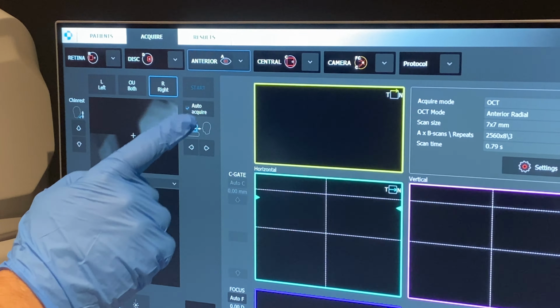Then if I open that, open the first image, then I'm just going to use Windows Viewer to scroll through the image. Because normally you can only scroll through an image whilst you're looking through the software, but this would be a way of looking through it. And you've got your red line for where you are. But of course this would be a much bigger file size. The PDF two-dimensional image is 1.86 megabytes. The tomogram series is 30 megabytes.